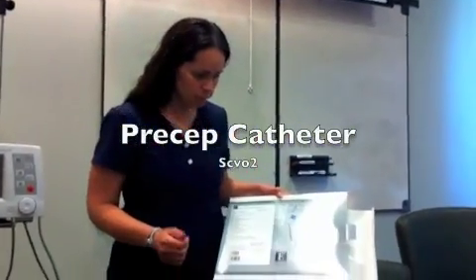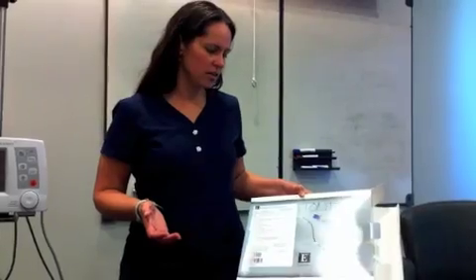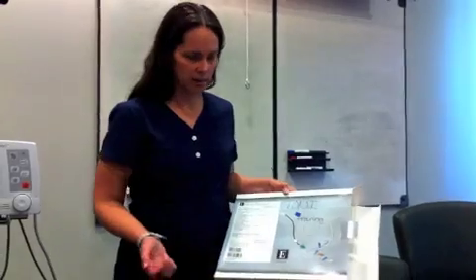We're going to go over the Precept catheter. The Precept catheter is used for septic patients. It's a separate catheter than a central line, but it still has three lumens to put your drugs through. So if you still want to monitor CVP, you can at the same time.